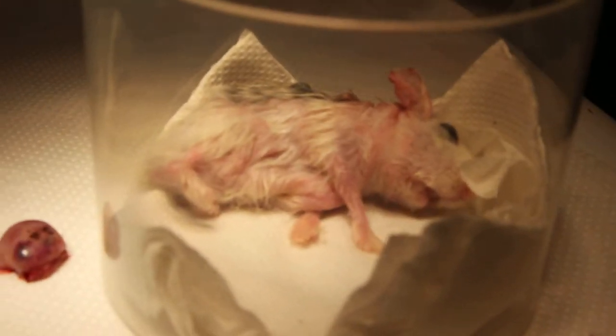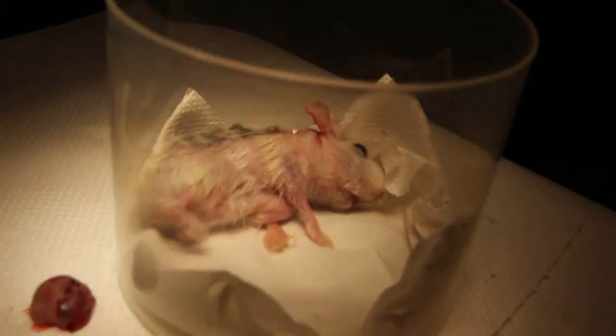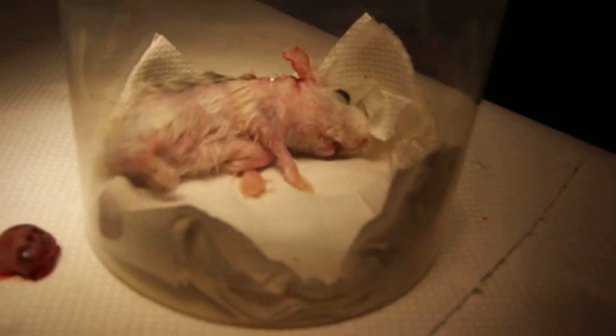Put it there. Bring the container to the hamster, not the hamster to the container. It's the other way around. So we will turn the container here, turn the other side — let me see all the view.